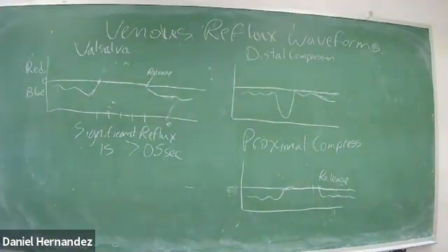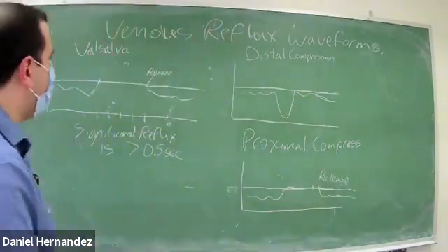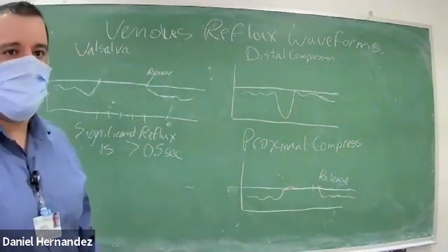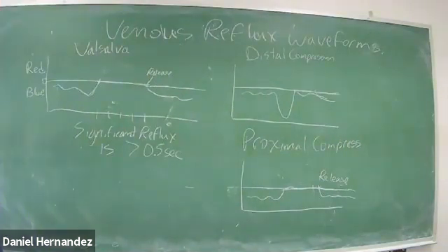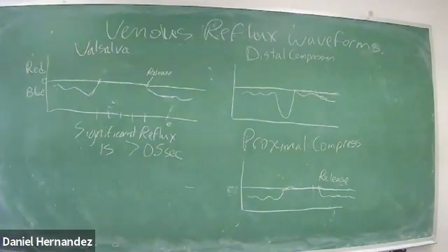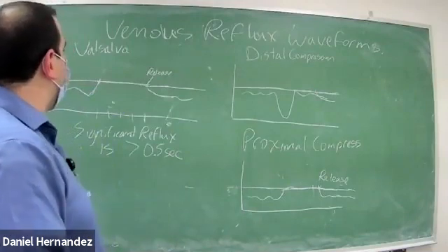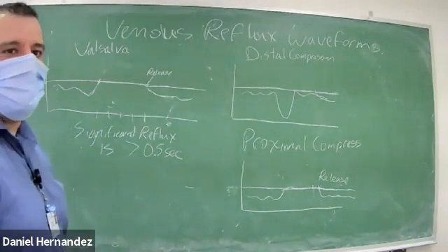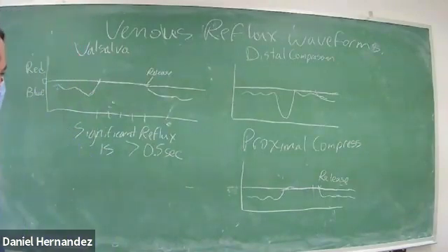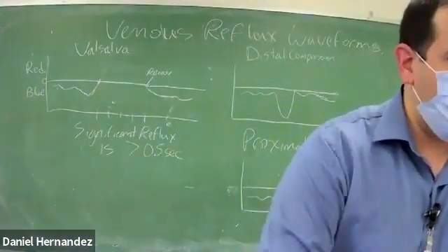So it's also important to understand too, for this class as well as for the registry, the correlation with color flow imaging. When it turns red versus when it turns blue or continues blue. Because sometimes the registry might try and trick you, they'll put the color box steered the wrong way and make the vessel red when it should actually be blue. We can go over that a little bit more as well.